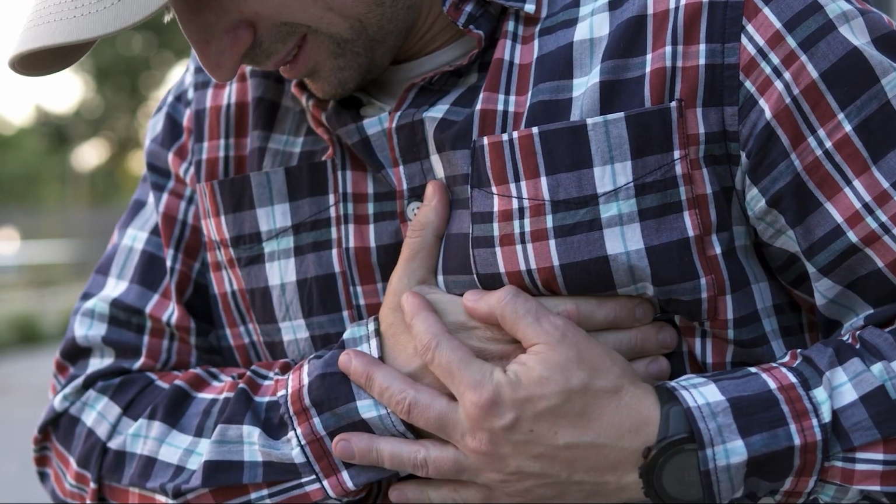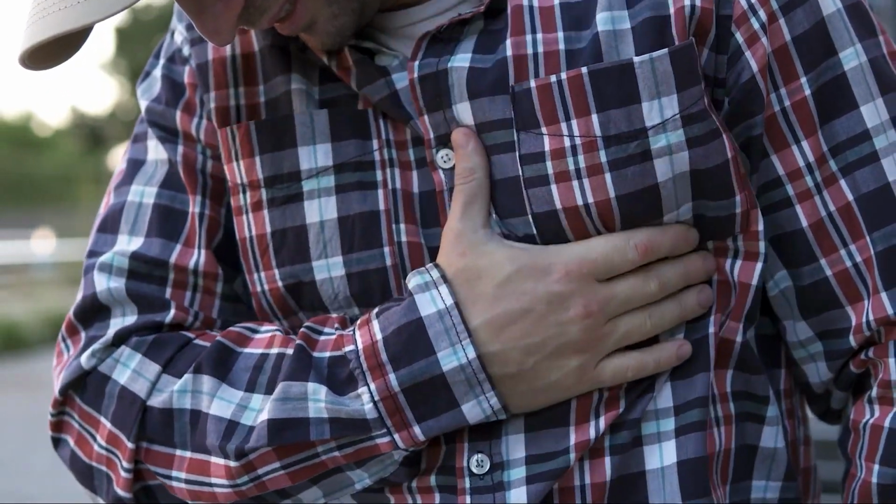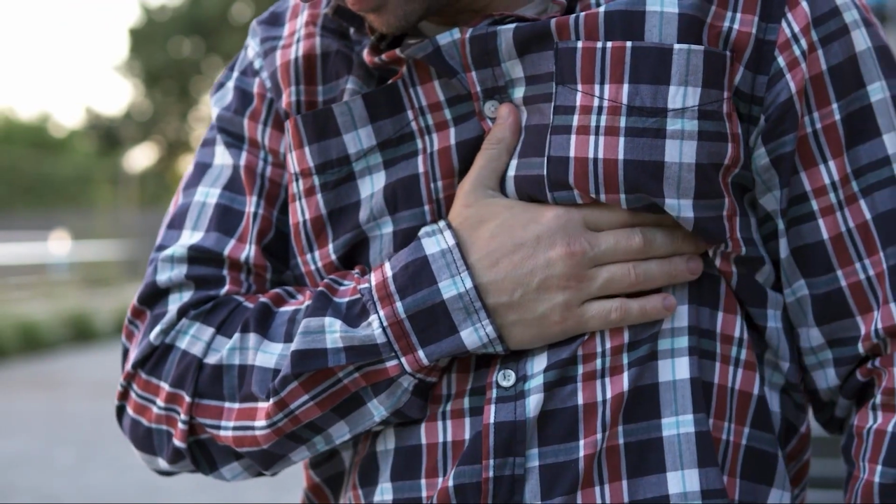All right, so let's take a closer look at the three MIs. First, we have myocardial ischemia, then we have myocardial injury, and then we have myocardial infarction. Let me jump to myocardial infarction just for a moment. That's the worst thing. And this cardiac situation can progress from ischemia to injury to infarction. Infarction is when you actually have dead tissue. We'll talk about each of those in detail in just a minute, but we need to be able to understand those on the ECG waveform and how to tell the difference. But let me just give you a practical understanding of what these might be.